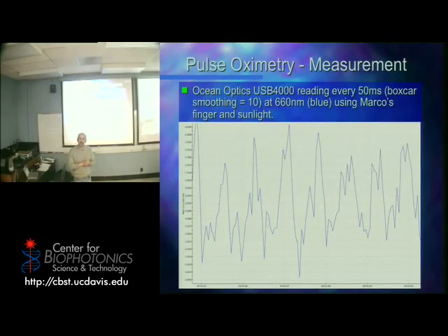What do you guys think? Does that sound right? Okay. There are 12 5-second increments in a minute. So 12 times 7, 84. So my heart rate was 84.